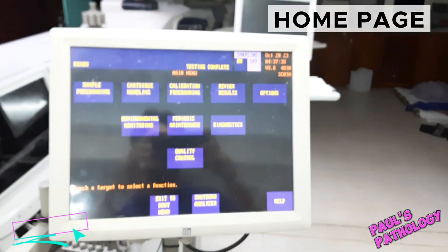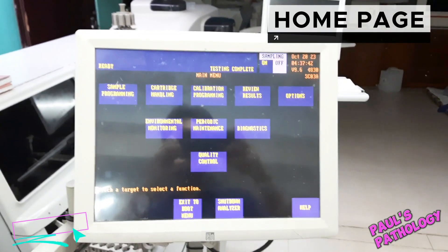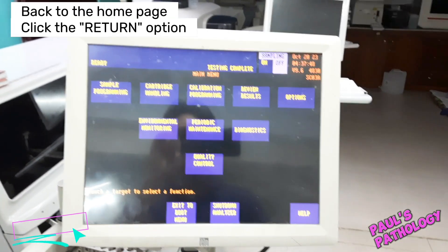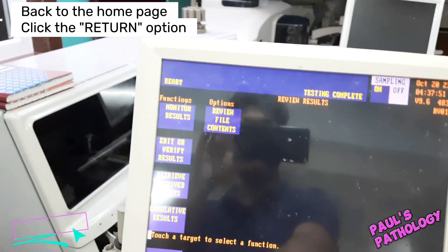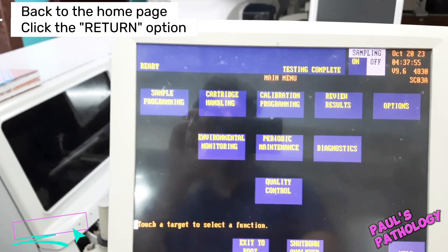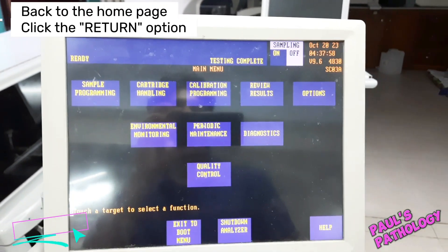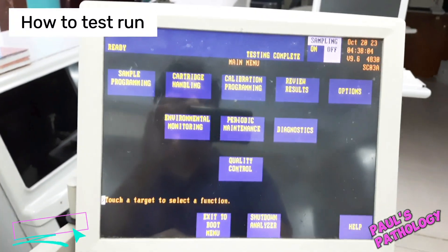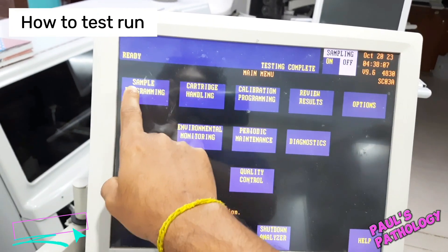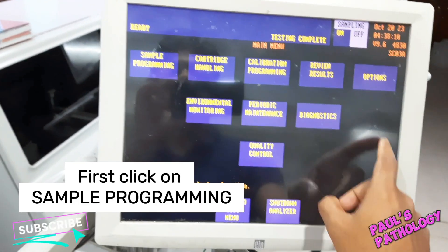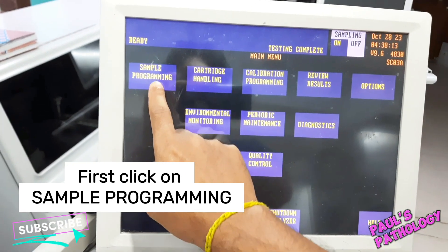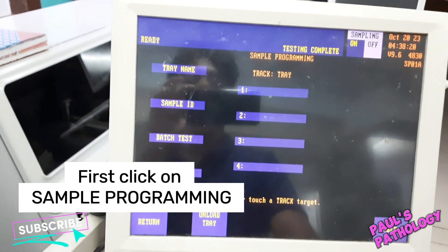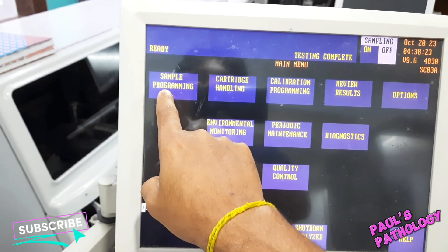We have to see how the Biochemistry machine is operating. We have to test run the test. Here we are going to test the test.